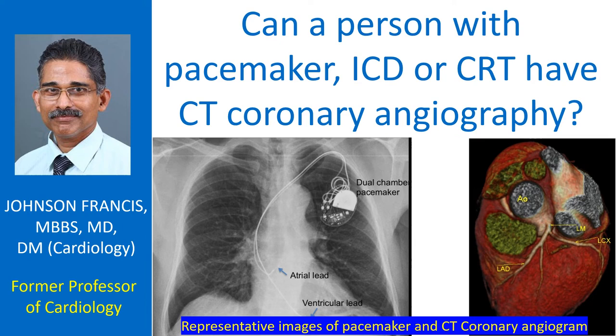This question is related to the potential problems of MRI in those with cardiac implantable electronic devices, which is well known. There are two aspects to this question. One is regarding the safety of computed tomographic angiography in those with implanted pacemakers and other cardiac implantable electronic devices. Second is regarding potential interferences in the evaluation of CT images due to the metallic structures in the implanted devices.